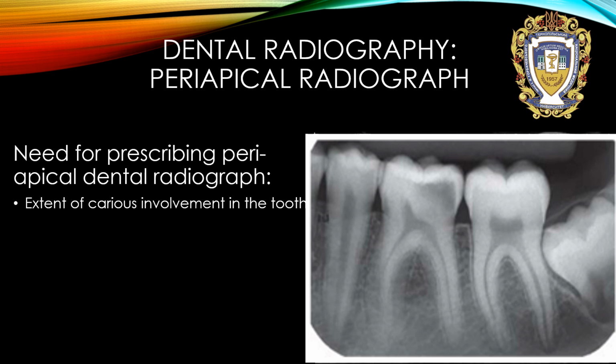A doctor sometimes cannot notice these caries during intraoral evaluation. But as you can see, the doctor can find it very easily in intraoral periapical radiography. Moreover, the caries on the opposite side.